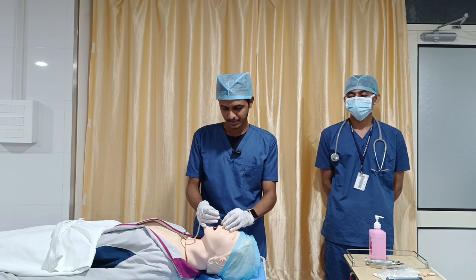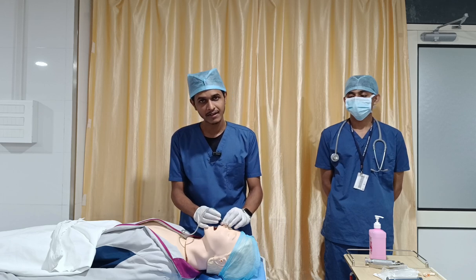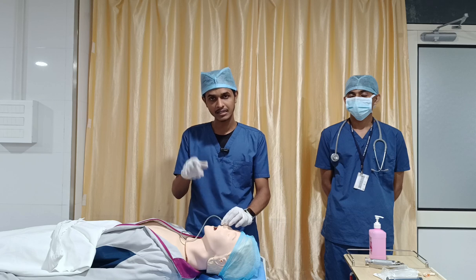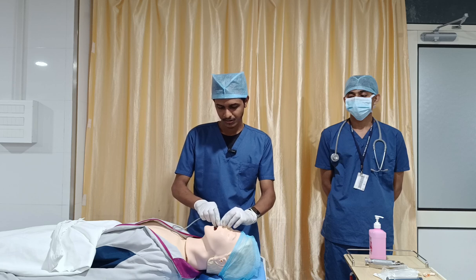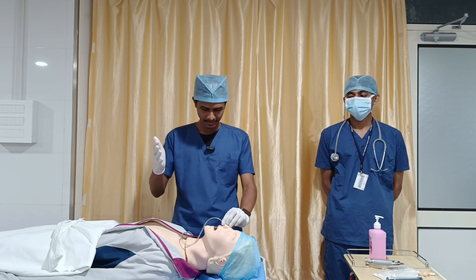Okay. So I am inserting, and while inserting you also have to check your oral cavity, that there is no recoiling in the oral cavity. This way I have to insert up to 70 centimeters. Up to 70 centimeters you have to insert, and then you have to stop. Here we have to confirm our placement.